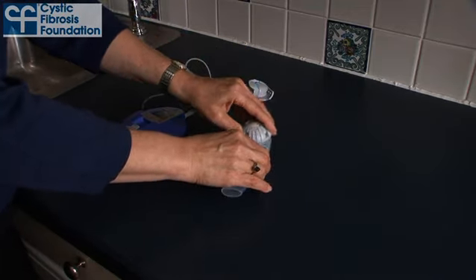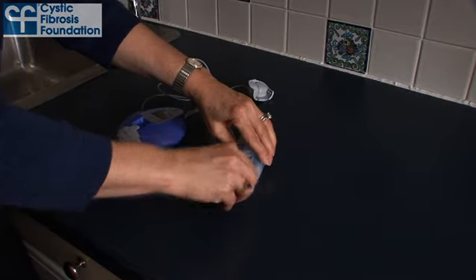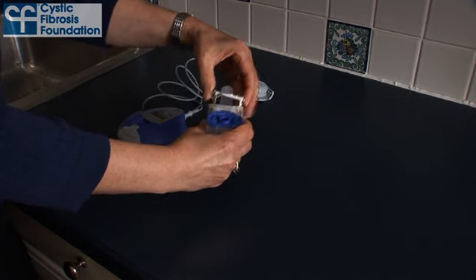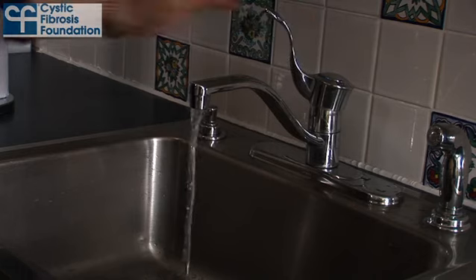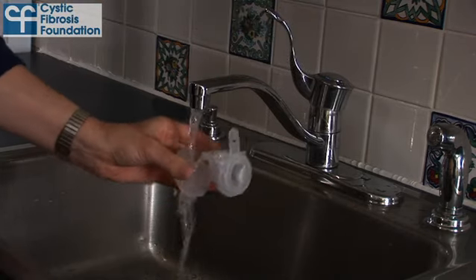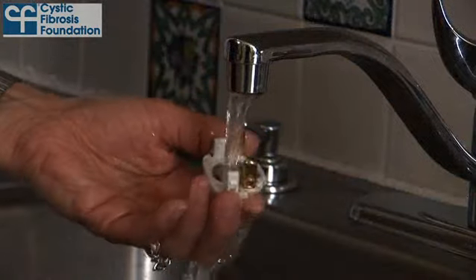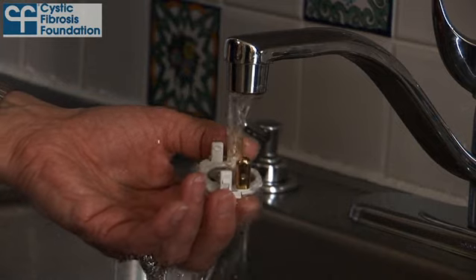Next, disassemble your nebulizer and set each part aside on a clean surface. Thoroughly rinse each part under warm running tap water for approximately 10 seconds. Rinse both sides of the aerosol head, being careful not to touch the metal membrane.